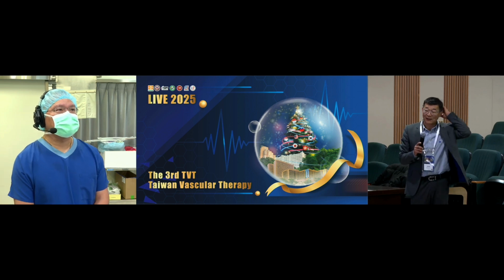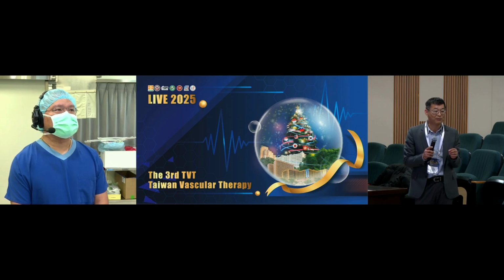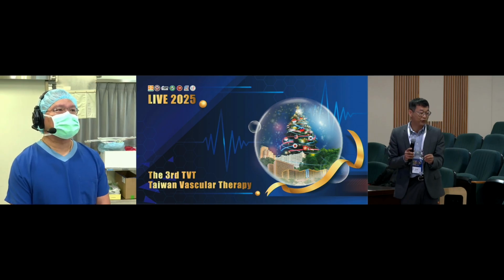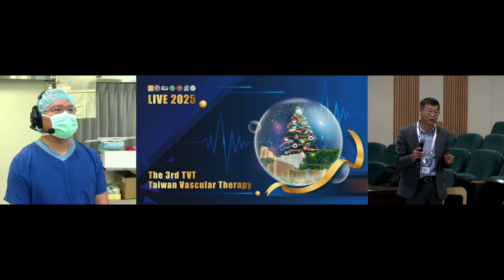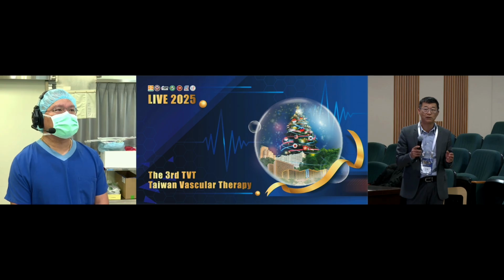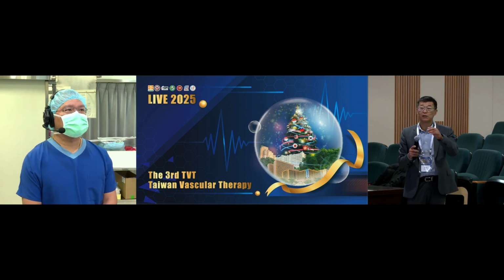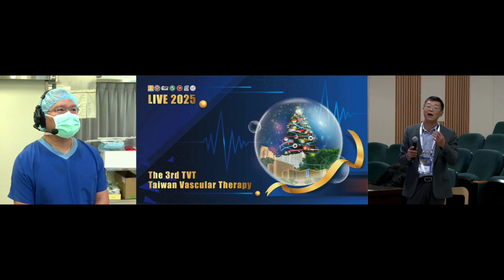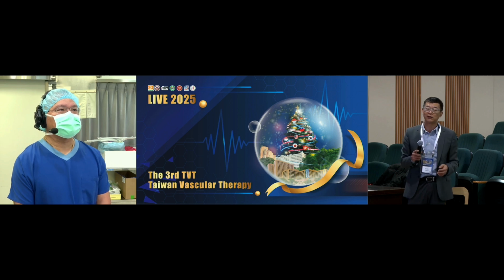The second thing is I'm curious about the acute limb ischemia management strategy in the circumstances of popliteal artery aneurysm, because the thrombectomy is not so easy. You do the CDT, you do the PMT, there will be some residual thrombosis inside the popliteal artery aneurysm. So, Dr. Zhang, can you tell me how you deal with acute limb ischemia with popliteal artery aneurysm?